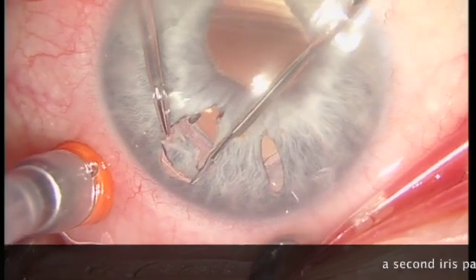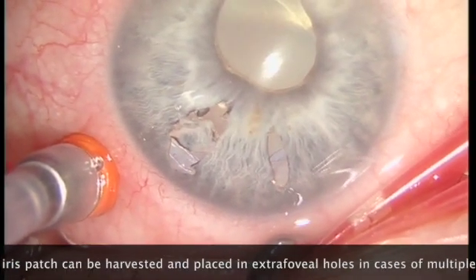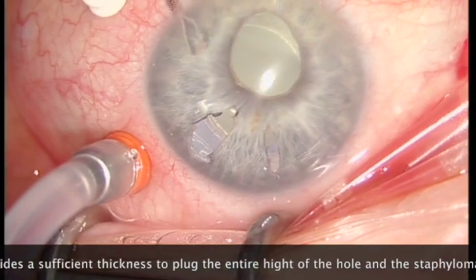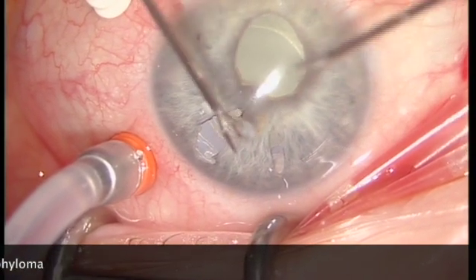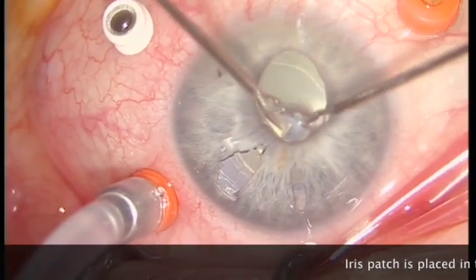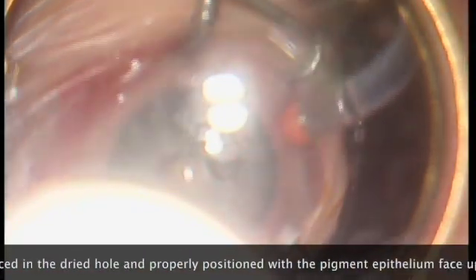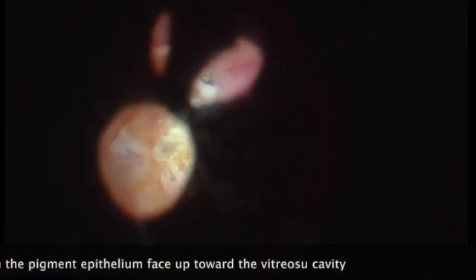A second iris patch can be harvested and placed in extrafoveal holes in cases of multiple simultaneous holes. Iris provides a sufficient thickness to plug the entire height of the hole and the staphyloma. The iris patch is placed in the dried hole and properly positioned with the pigment epithelium facing up toward the vitreous cavity.